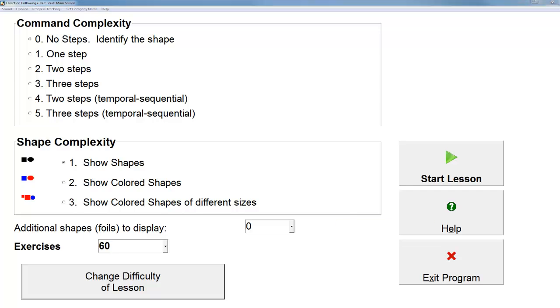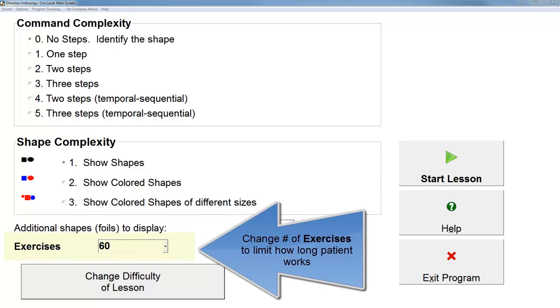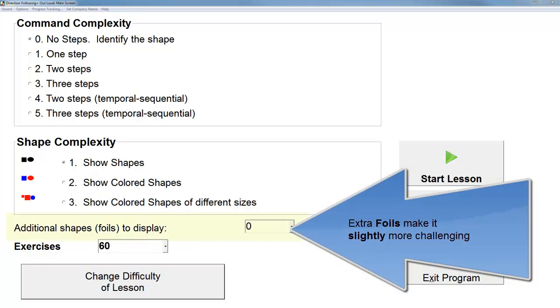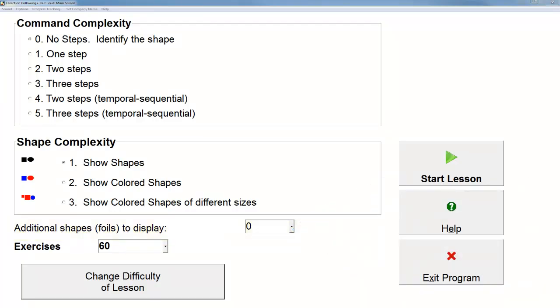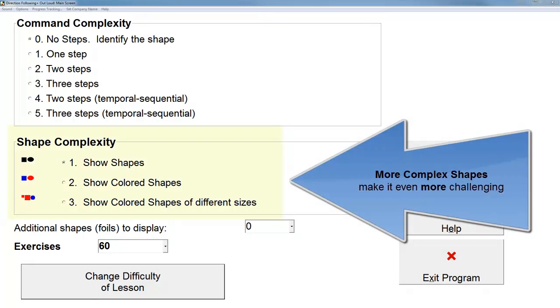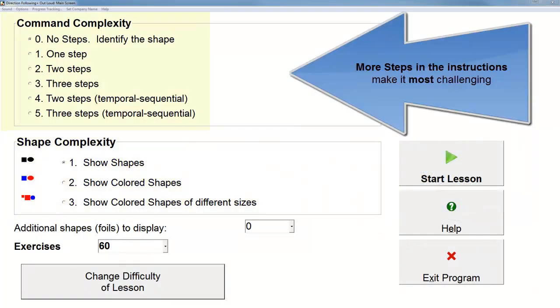The first screen you'll see is the lesson selection screen where you can set the difficulty. You can set the number of exercises to determine how long the patient works on the lesson — more is harder. You can add additional foil shapes to make the lesson slightly more difficult. You can also make it even more difficult by increasing the complexity of the shapes: colors and sizes. And to make it the most difficult, we add steps to the instructions.